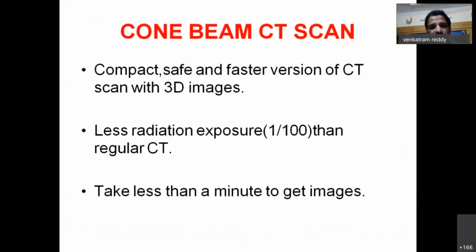Now coming to the cone beam CT scan, I think as a postgraduate you need to know what a cone beam CT scan is. But in ENT, this is a very compact, very safe and faster version of the CT scan with 3D images. The cone beam CT is already available in many places, and it gives much less radiation compared to the routine normal CT scan. Almost the radiation exposure is 100 times less than the regular CT.